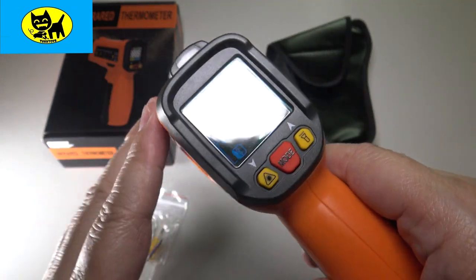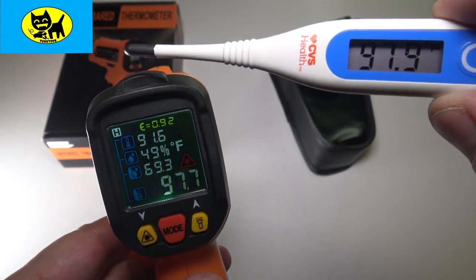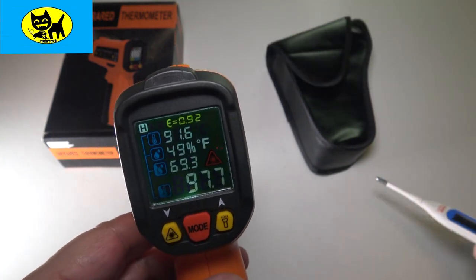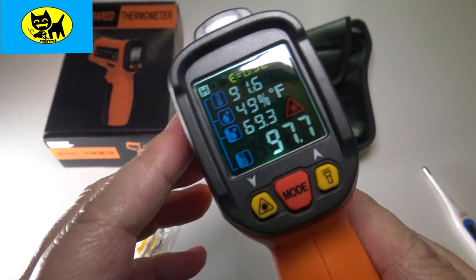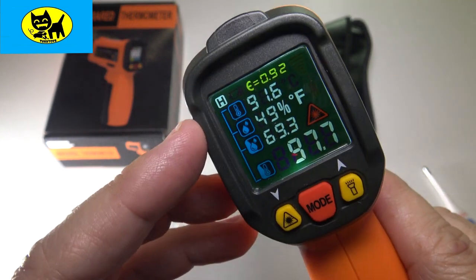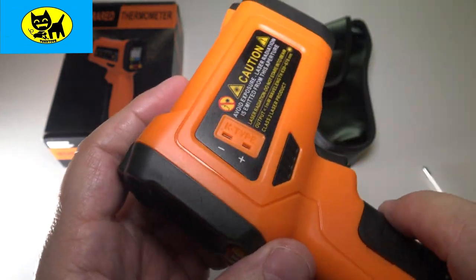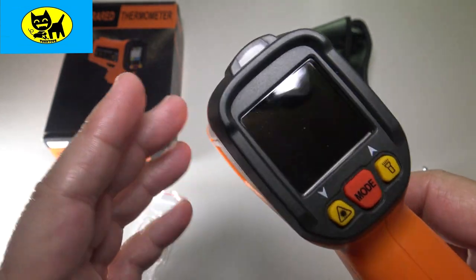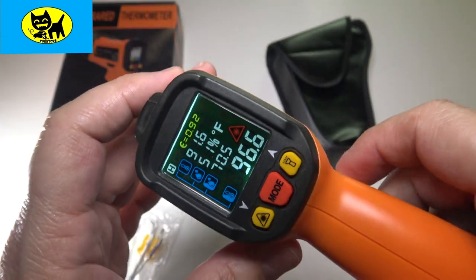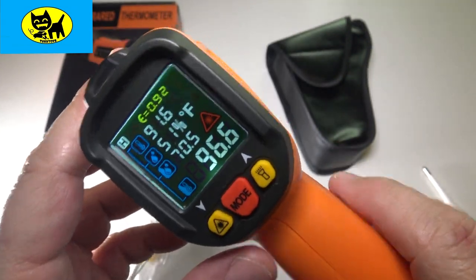I used the old-school CVS electronic thermometer and got 97.9, which is pretty normal — coronavirus-free. I then used the infrared thermometer on my forehead and got 97.7, so very very close. The CVS one could be off from moving around under my tongue. Not only did the infrared thermometer tell my temperature, it also gave humidity and dew point readings. I'm going to test this in the field and let you guys know what I think.